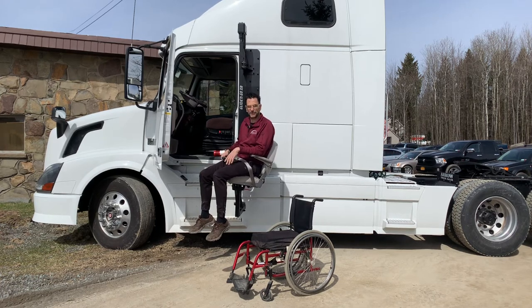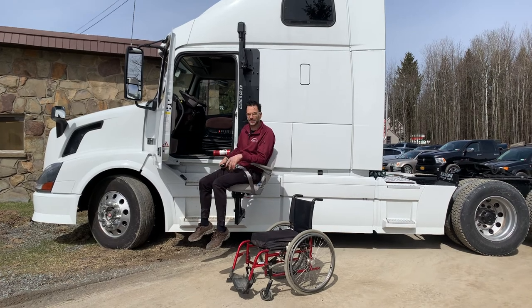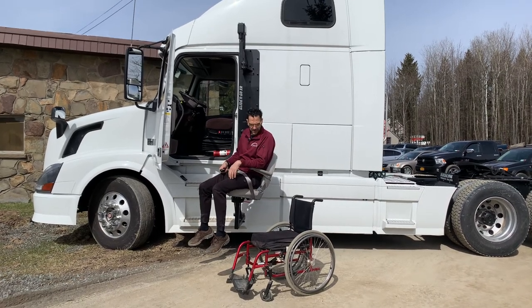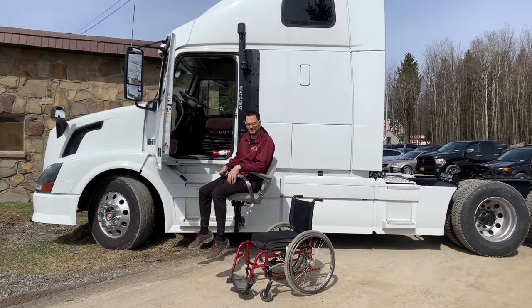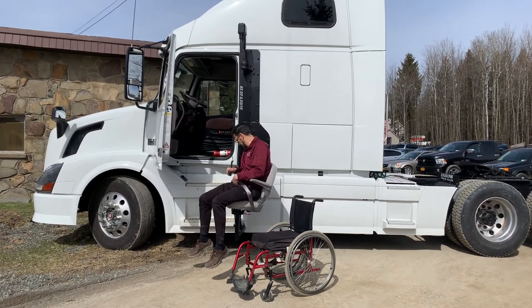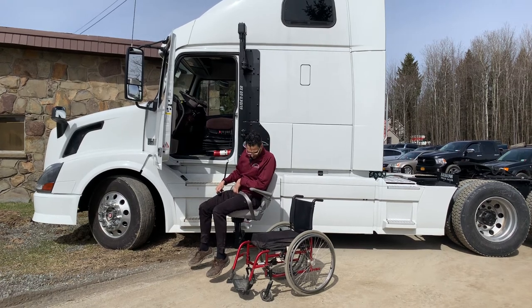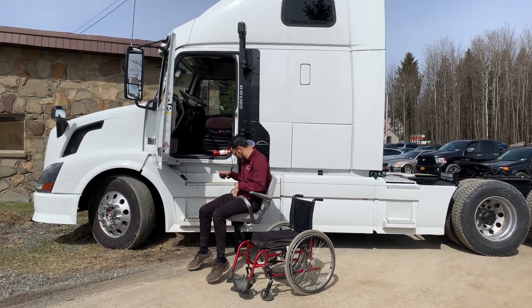Obviously that's a little bit more time consuming. What a lot of users do is they just keep a chair inside the truck and they have one at their destination and one at their start. X-frame manual chairs are fairly affordable, so that sometimes makes better sense for people.